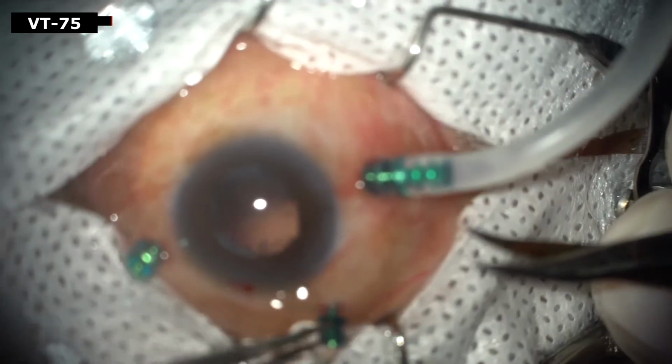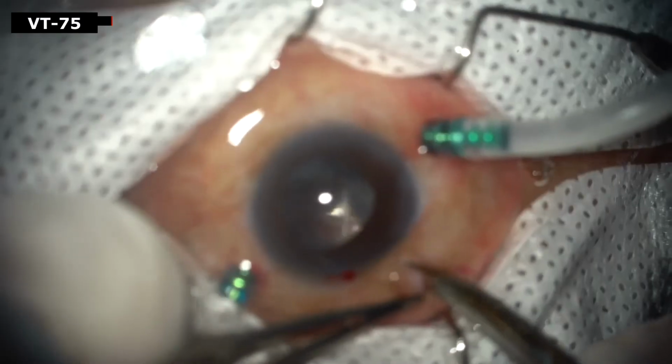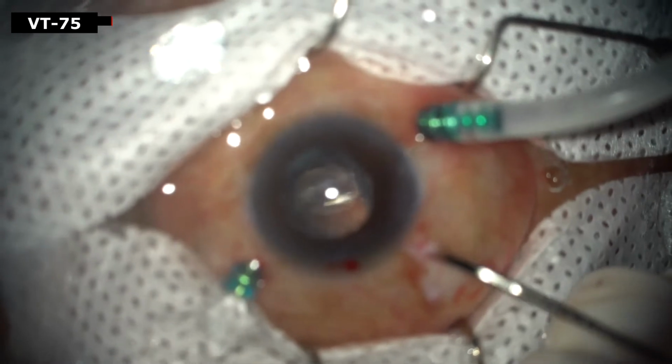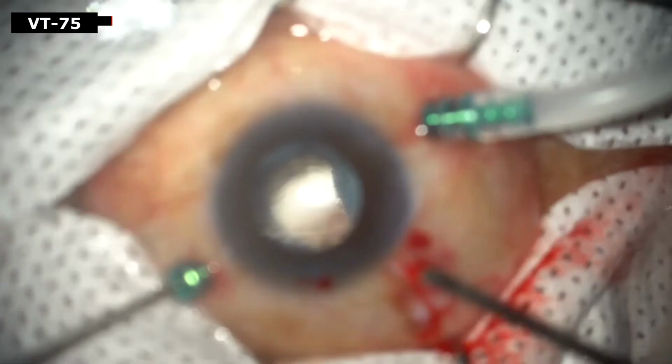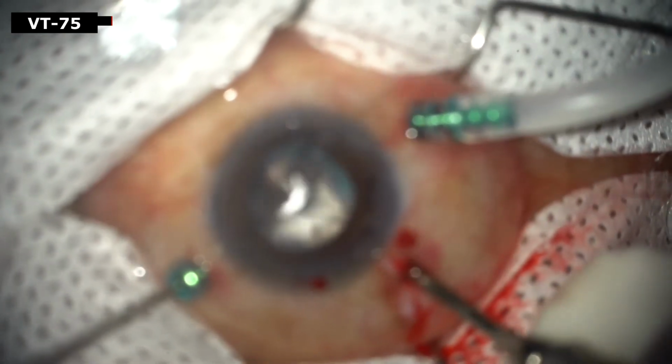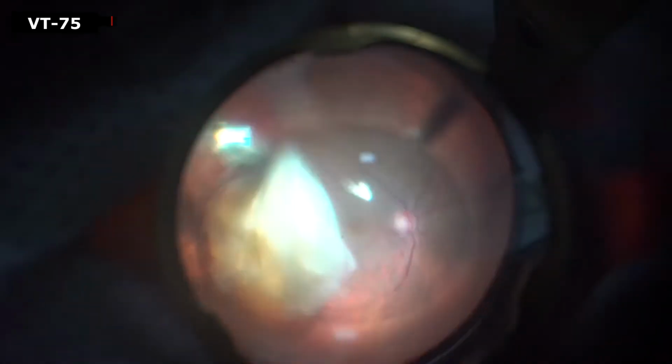One of the sclerotomies was enlarged with a MVR knife for the passage of the phaco tip. The nucleus was emulsified in the vitreous cavity with a phaco tip.